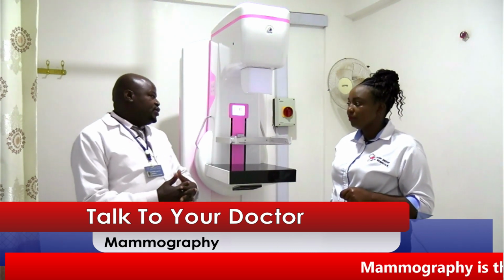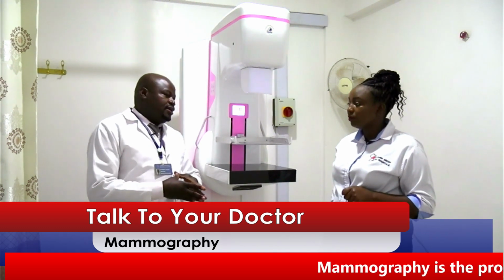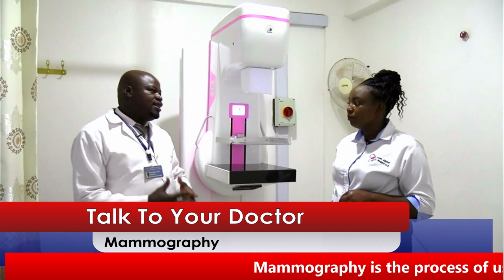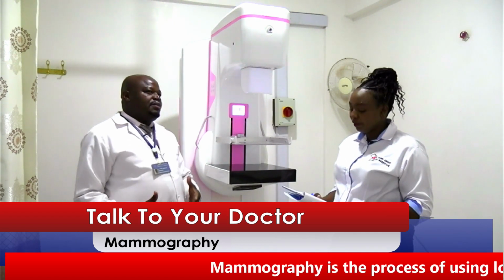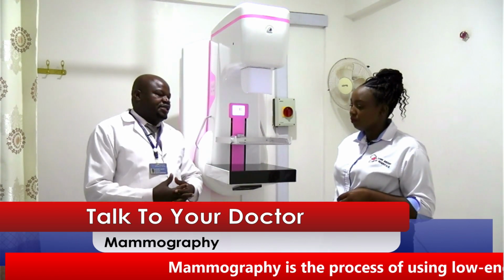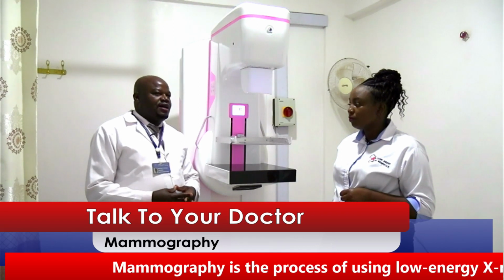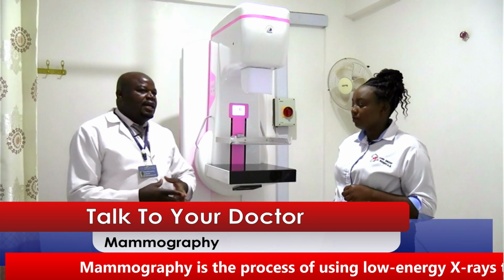Mammogram is a radiological imaging examination that is carried out to check on the breast's pathologies. So whenever you have a problem with the breast pathology, then you use the mammogram. Although there are other modalities like ultrasound and MRI that you can still use to examine the breast pathology, mammogram is the best to diagnose breast pathology, especially if the patient has a breast lump, breast pain, swelling, and many others. So there are two types of mammogram. Number one, we have what you call screening mammography, and the other one is the diagnostic mammography.